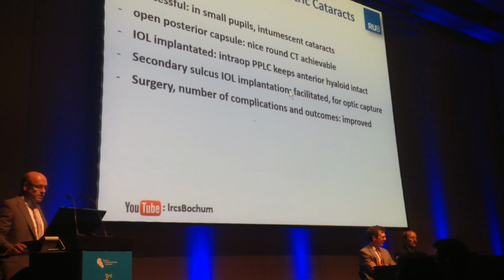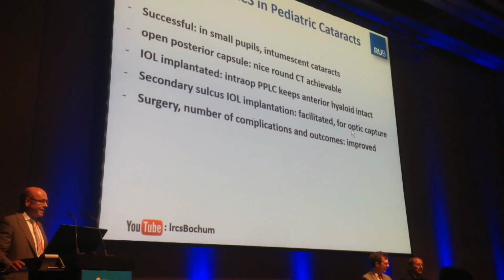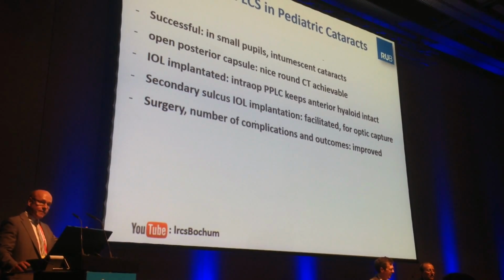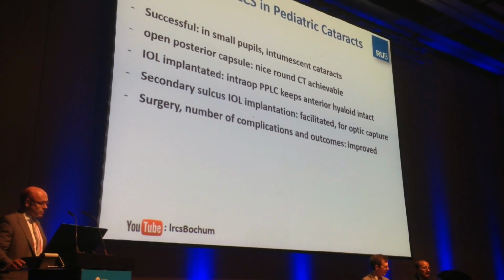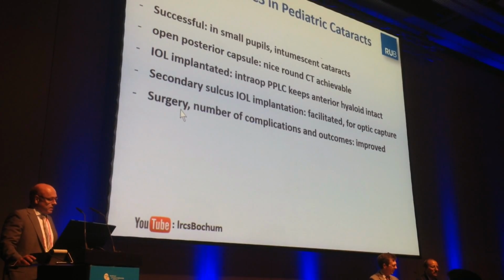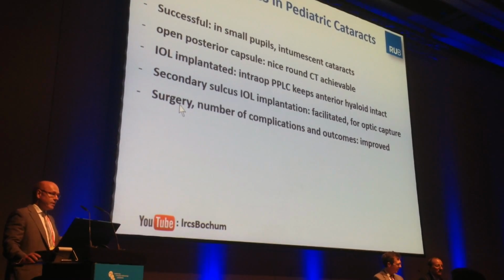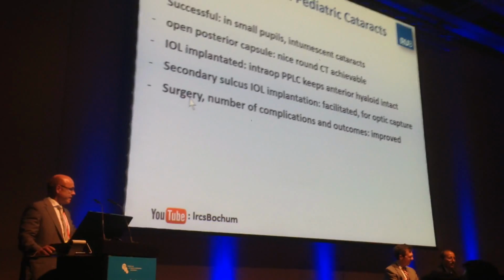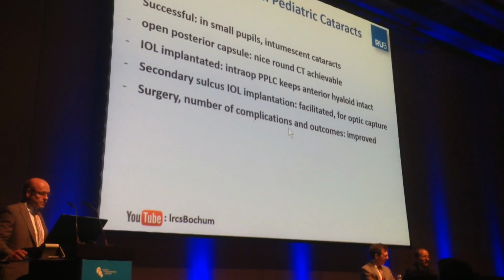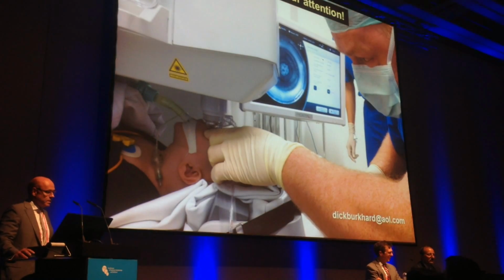Secondary sulcus implantation is possible and facilitated, even then for optic capture, which I like, implanting the lens into the ciliary sulcus with optic capture of the optic through this opening, well designed, well centered, etc. So I see a clear improvement in my surgery, having had beforehand 15 years dedicated to pediatric cataract surgery. Definitely the number of complications tremendously decreased and outcomes improved. And I have no financial interest. Thank you for your attention.